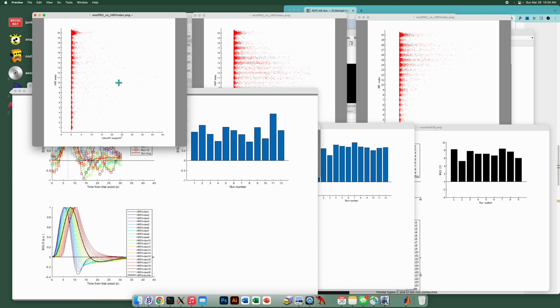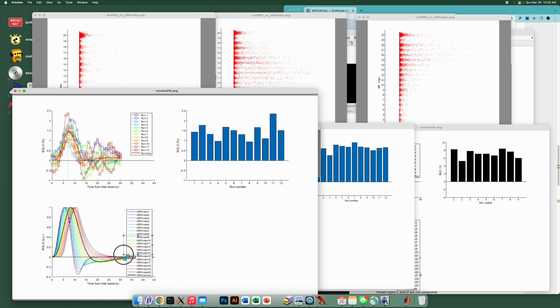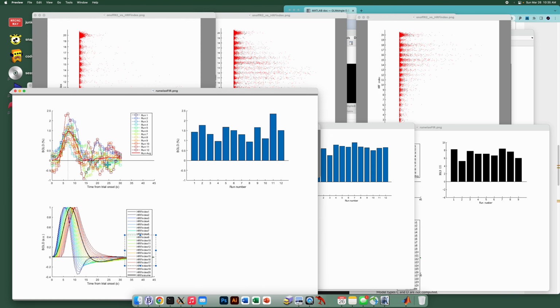In fact, we can do that in this plot. So remember, this is the same data set, and we had noticed, at least by eye, that for the few voxels that carried signal, the algorithm was choosing between 9 and 17, let's say, HRF indices, and that would actually correspond to these colors here. So kind of a greenish to reddish color, which would be roughly peaks around here. And if you just eyeball that up here, it does seem sane, does seem correct that these HRF indices should be the ones selected for the voxels that carry signal, which is consistent with this look at the data, which again is our diagnostic FIR model.